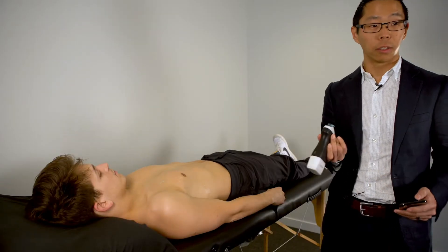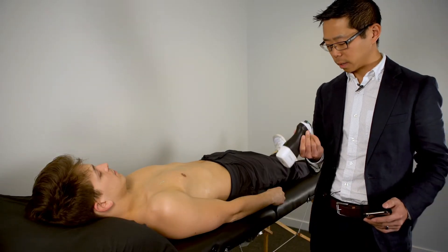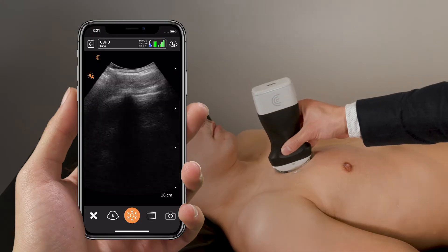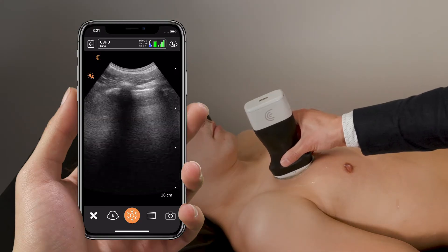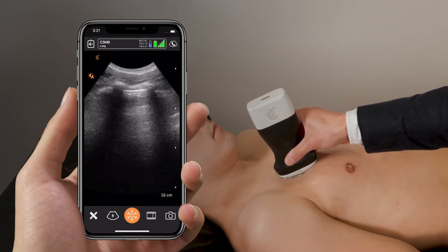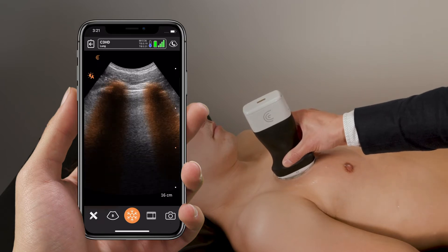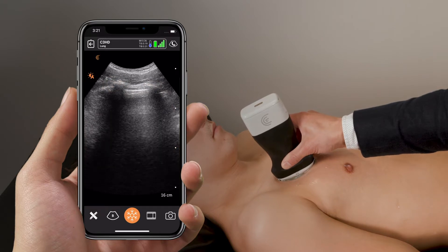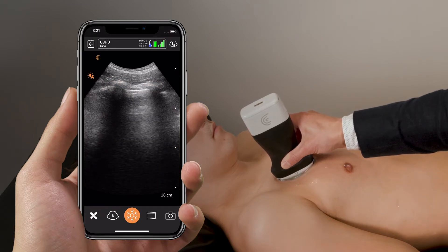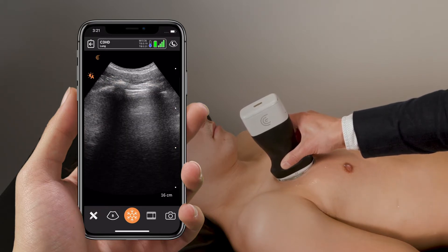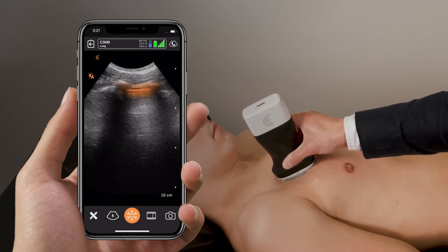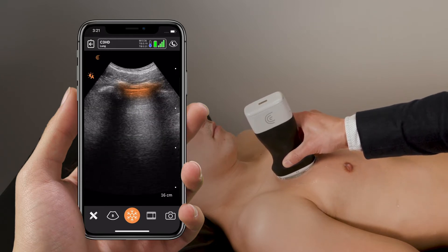We're going to place the ultrasound probe with the marker pointed upwards in a vertical position in the midclavicular line. Our landmarks here are going to be our ribs. The ribs are hyperechoic with black shadowing behind — bright and white with black shadowing. We're interested in the bright hyperechoic pleural line in between, which will have a shimmering movement as we visualize it.